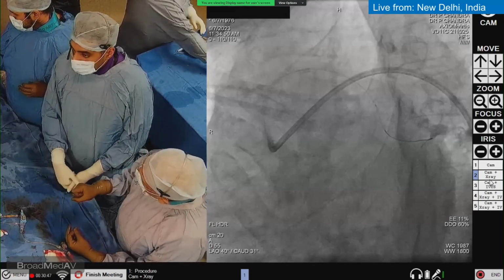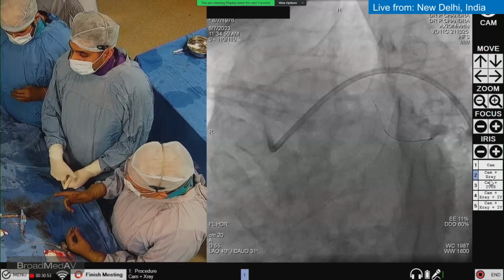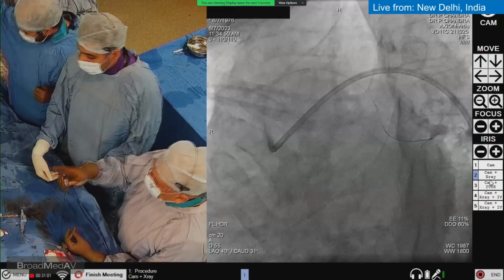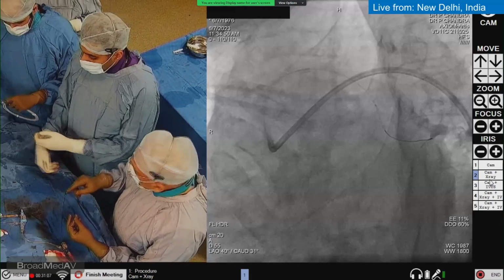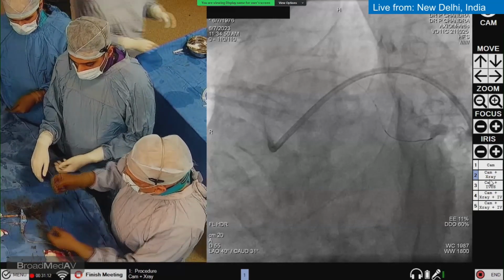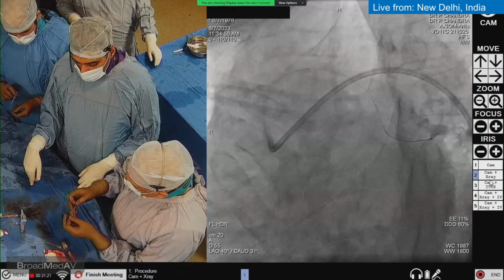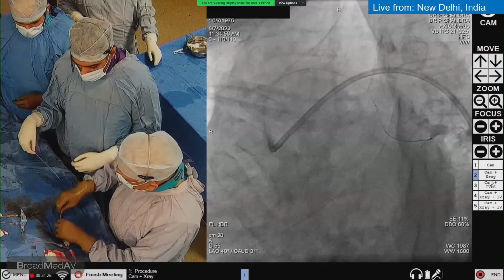So the plan is to take a drug eluting balloon because, as I already said, if we put a stent, there is a very high chance that the flow in the OM will completely stop. There will also be an issue for the LAD, which arises from that bifurcation just near this lesion in the circumflex. So here it is, a 2.5, 2.75, 15, and this is a solution drug eluting balloon, a sirolimus eluting balloon from Medalines.